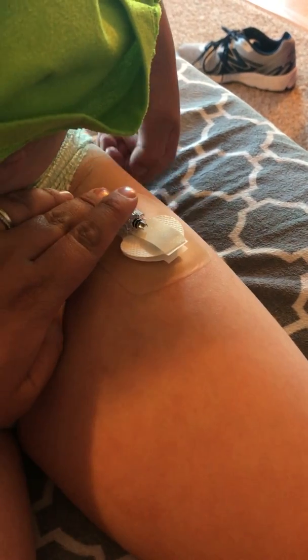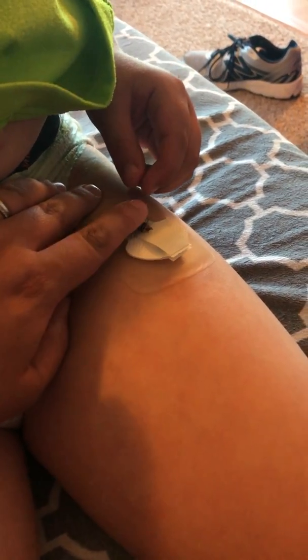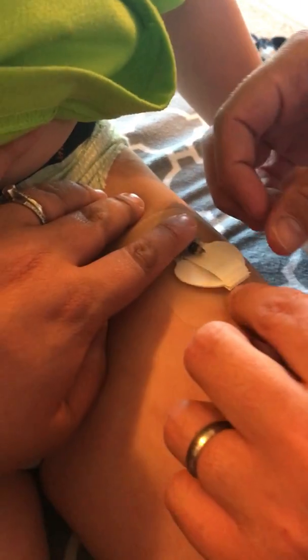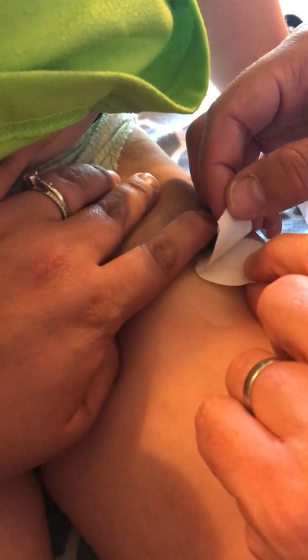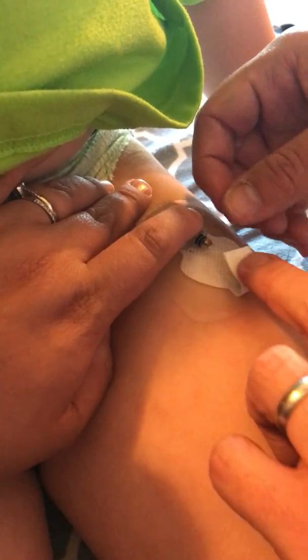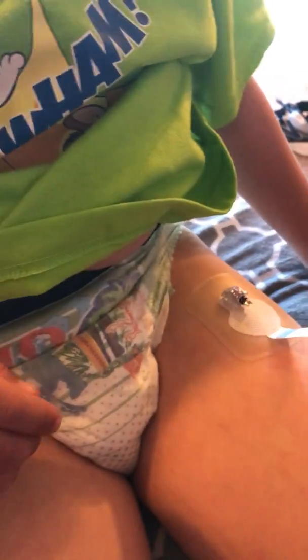Okay, now this is the big part because this hurt him a lot. You want to make sure you don't screw up at this part. So, can you unpeel? There's a little sticker you'll see. You'll grab the tab and unpeel. He could also help you with this too, but these are just the steps you don't want to forget. It's good just to kind of hold this because if that comes out, then you have to do the whole thing over.